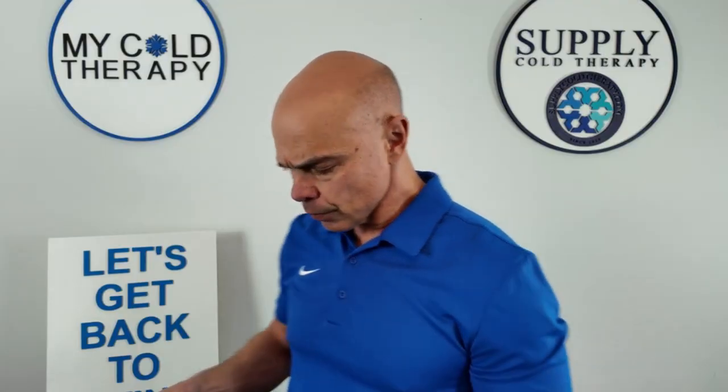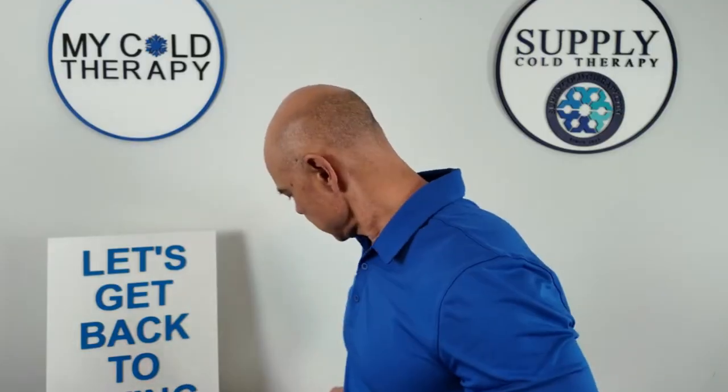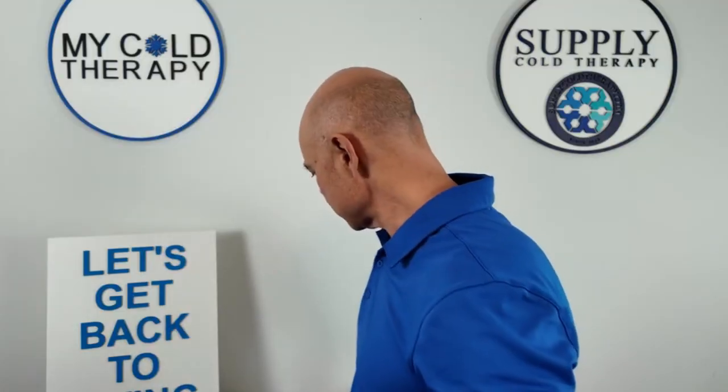Now again, cold therapy is 20 minutes on, 20 minutes off, but you don't have to keep going back and forth. You can just leave it there and put it back on. SMI, I want to give everybody here a heads up. They do sell gel packs without the cold packets. I wouldn't recommend it. I would get the gel wraps with the packets. So just be aware of that. If you want the long-lasting duration, get the ones with the 2 colors inside.